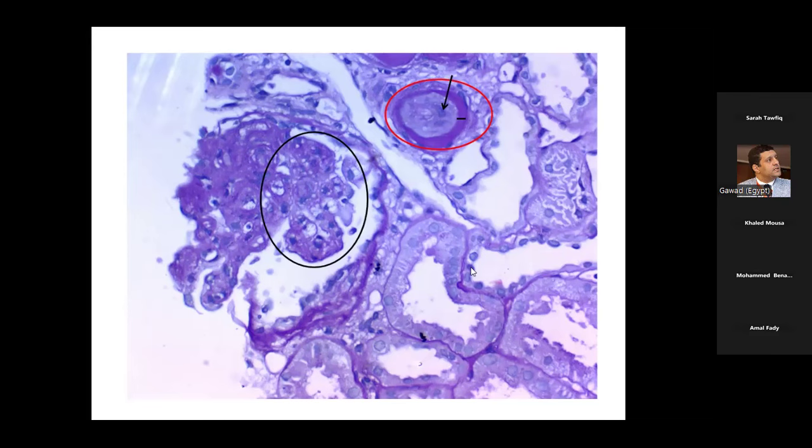Most of the answers are going with nuclei. That's a nucleus. The nucleus is of that color, rounded and of blue color. The surrounding something else is its cytoplasm, which is normally not seen in light microscope because it is normally thin, as we said. Here, the cytoplasm is ballooned, is big and occludes the capillary lumen.